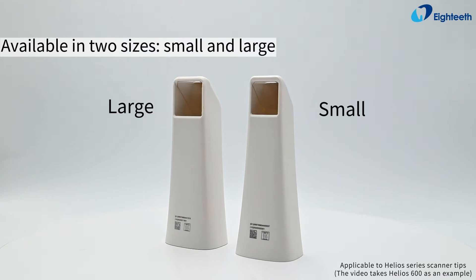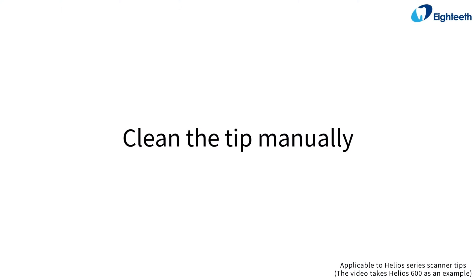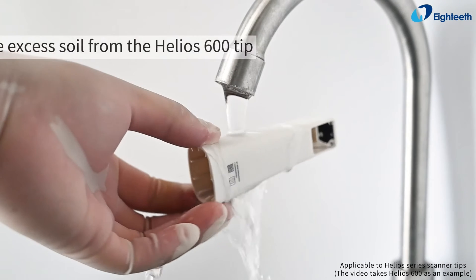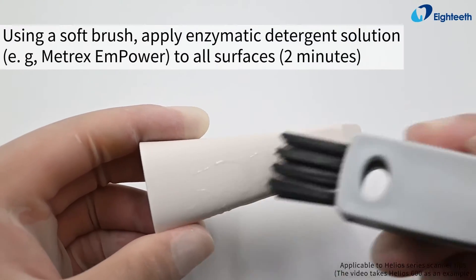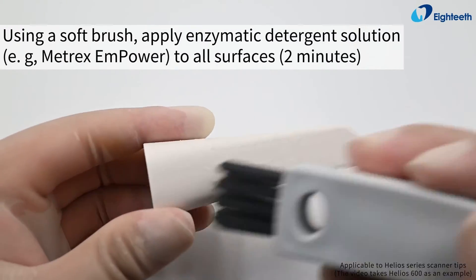The Helios 600 tip is available in two sizes: small and large. To clean the tip manually, rinse excess soil from the tip using a soft brush, then apply enzymatic detergent solution to all surfaces.